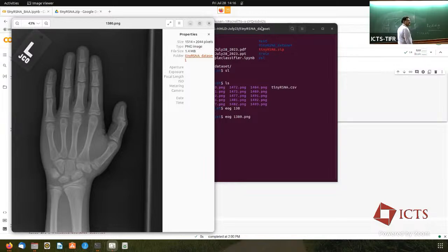Typically, you can consider all sorts of functions. A quadratic square loss, mean squared loss, would be a reasonable error if you're looking at a regression problem. All of you know this from linear regression, so I don't want to belabor it. The standard Euclidean norm: take all the values here and all the values here, find the square distance, and let that be your regression function. You can choose other regression functions.